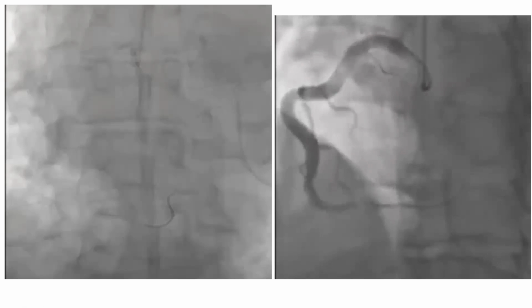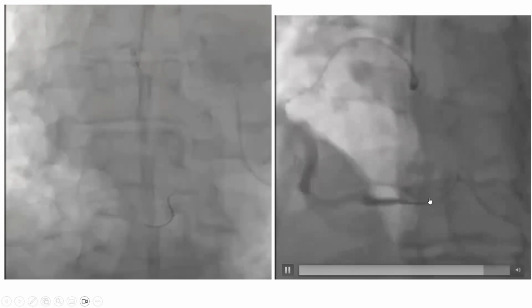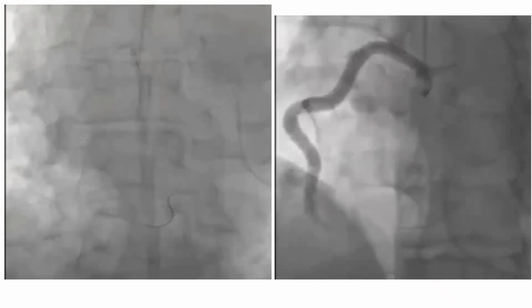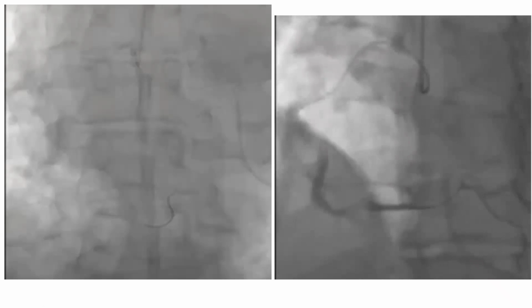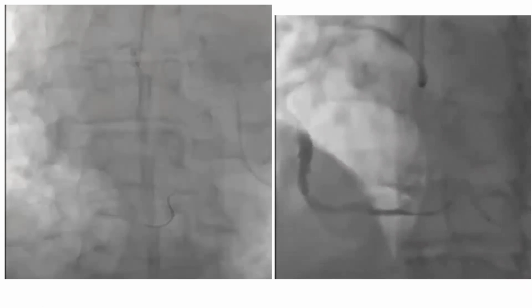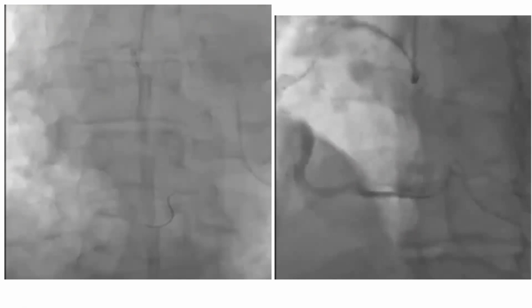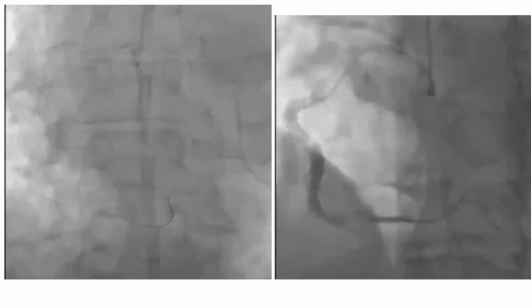If you choose to stent, you have to absolutely make sure there is excellent flow, a lot better than what you see here, and you need to have significant clearing of the thrombus burden before stenting. Even then, I suspect that there is high chance of distal embolization and shutting the flow once you stent. So you have to be ready. Even in the ideal situation, if you stent such patient with heavy thrombus, you have to be ready that he may decompensate and he may have arrhythmia after you stent.